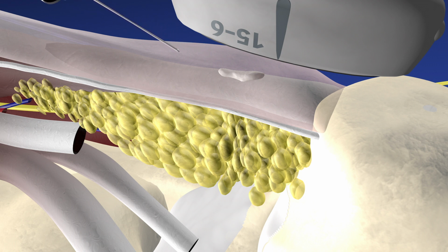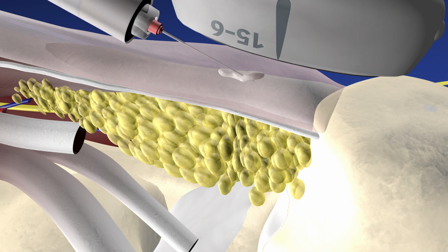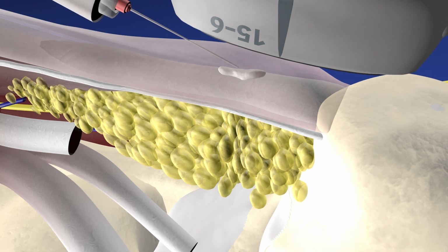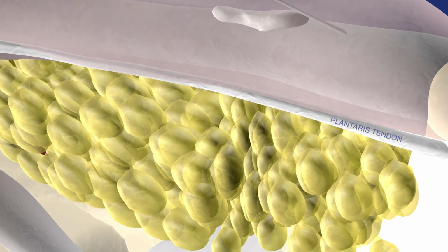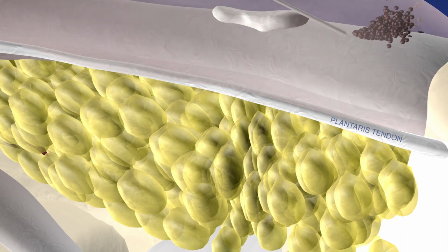Here we are changing direction of the needle. Try to cover as much territory as possible through one needle stick. And we're going into the calcific density itself. And also appreciate the plantaris tendon on the medial aspect of the Achilles tendon. And here we are, we're zooming in, and we're going to initiate the platelet-rich plasma injection. You can see the platelet-rich plasma being injected into the distal Achilles tendon.